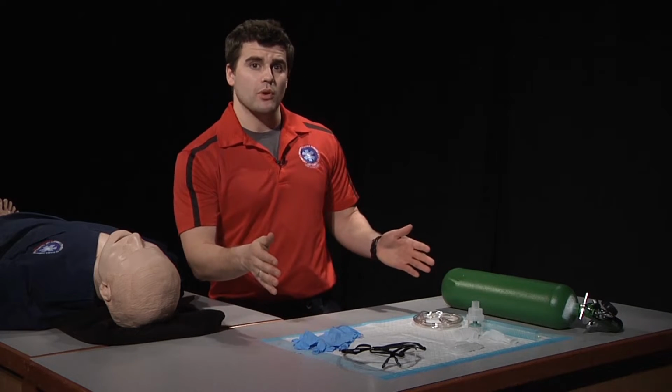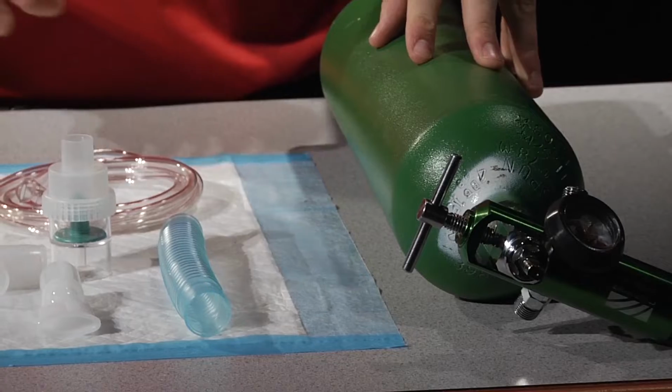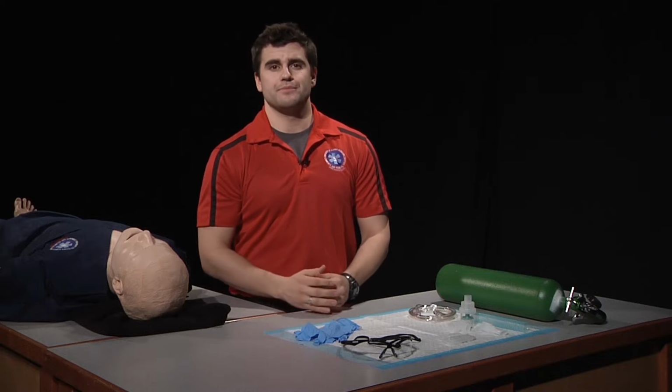After that, we want to assemble our equipment. The equipment that we'll need for this skill is an oxygen tank, oxygen tubing, a nebulizing unit, our medication, and our personal protective equipment. Now we're going to select the appropriate medication and confirm it with our 5 medication rights.